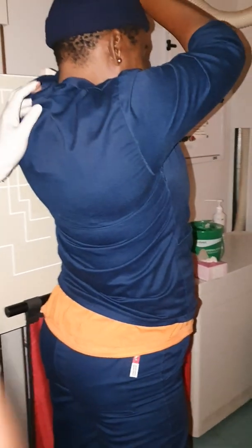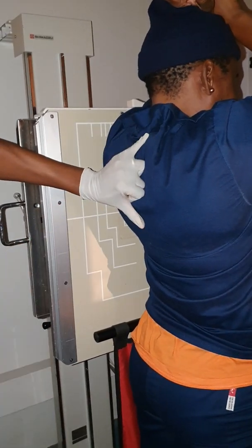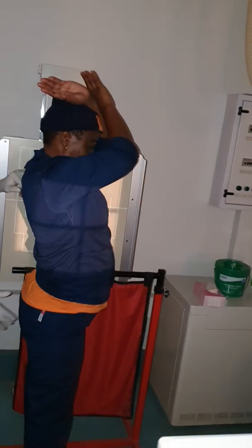You will center along the level of C7/T7. You will locate it 18 to 20 cm below the C7 protuberance. You will ensure your patient's body — anterior aspect and posterior aspect — is within the collimation field.